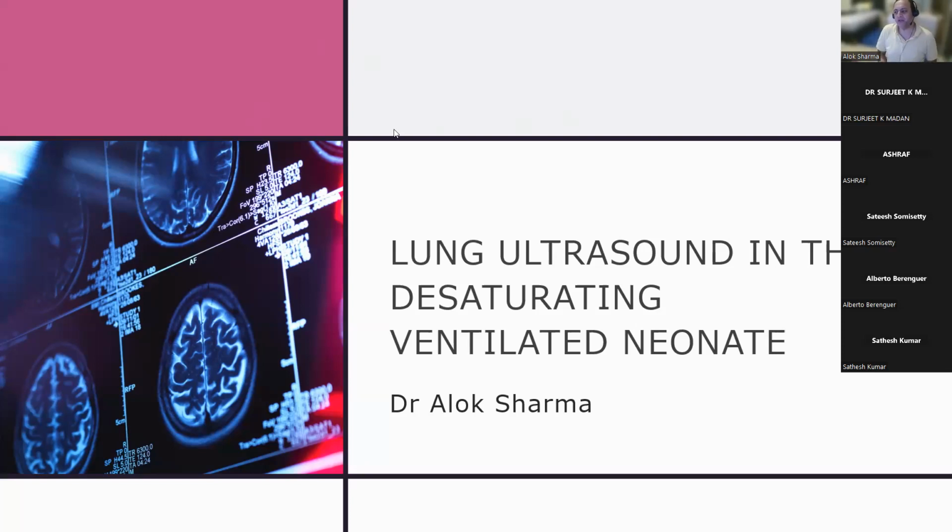The reason I want you to work in groups of two each is that whenever you're learning lung ultrasound on your unit, you might have more than one person who's skilled in being able to do it. Whenever I'm confused or I want a second opinion, I might go to a second person and say, well, have a look at the baby and have a look at my images and see what you think. The advantage is two minds work together. You can mentally model and you can really come to a conclusion very quickly.